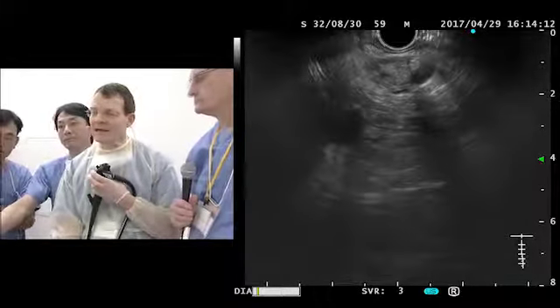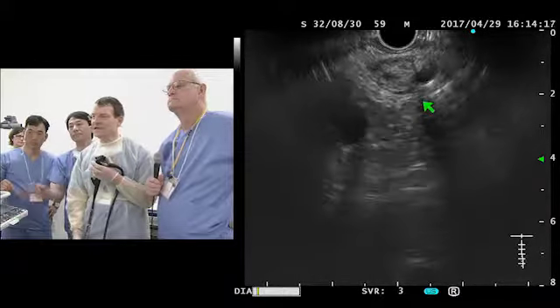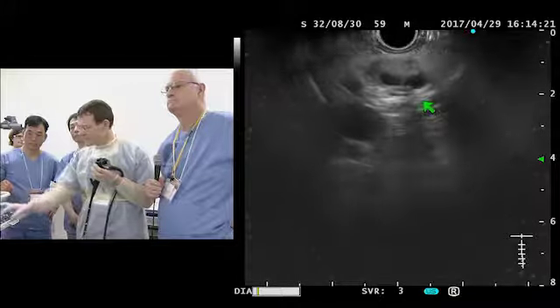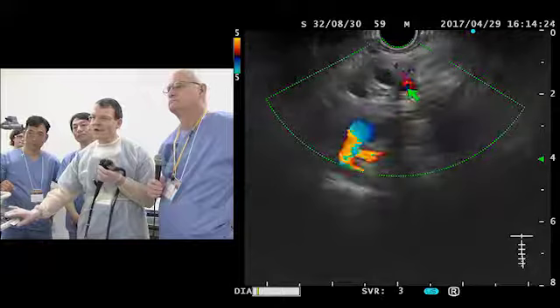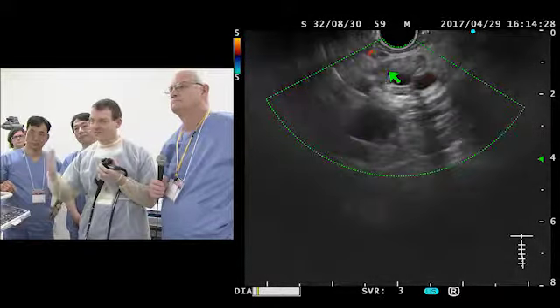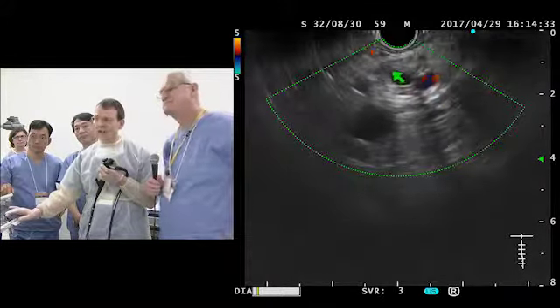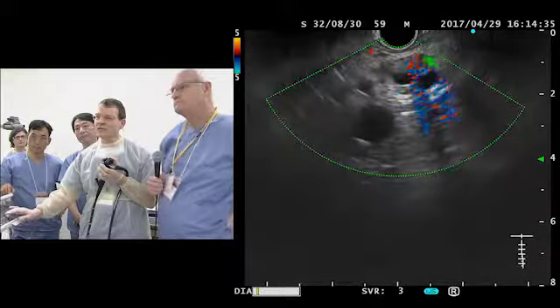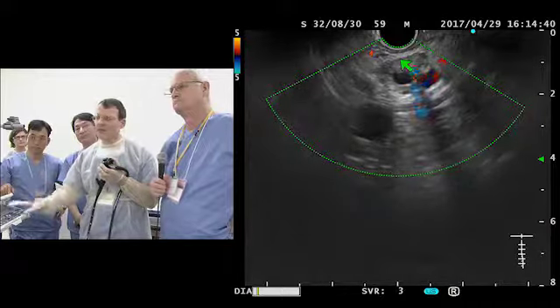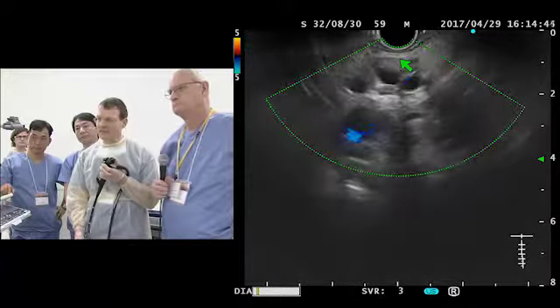And you will notice here already we don't have a huge pancreas like regularly. We see here already an atrophic pancreas, and now I use the flow. So we have identified the pancreatic duct. First, what we notice is that the pancreas is relatively small in this area, and also around this duct we see somehow echo-rich, somehow echo-poor area around the pancreatic duct.